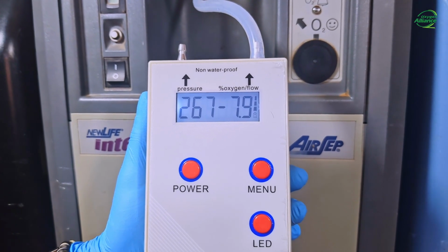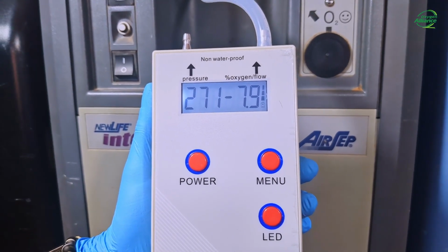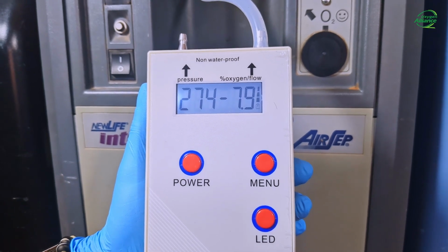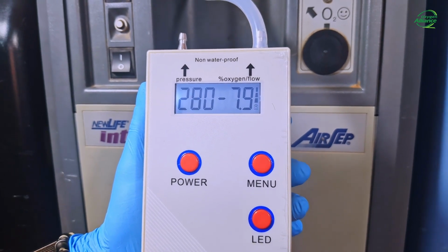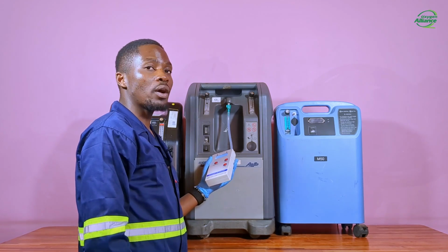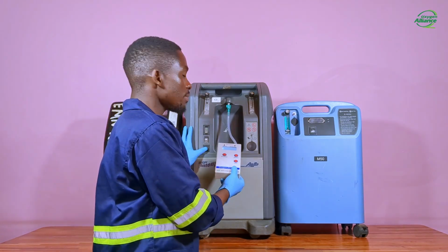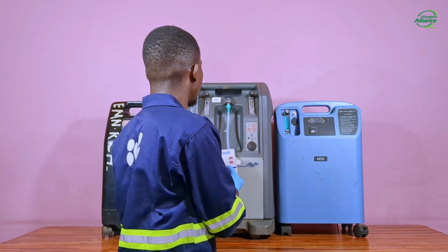So as you can see, we're getting a purity of around 27%, which is very low as compared to the recommended values. Now I'll turn off the machine and troubleshoot the problem.